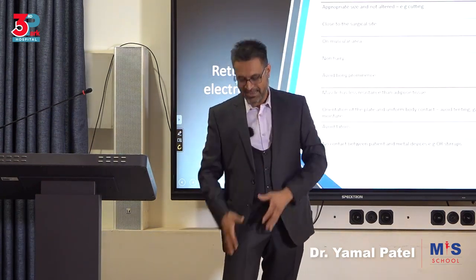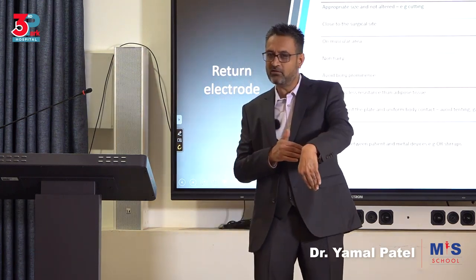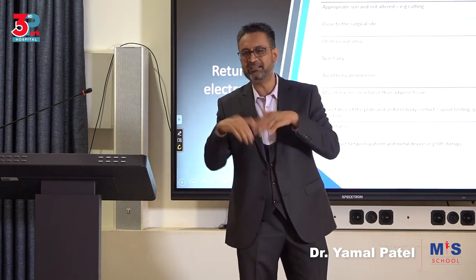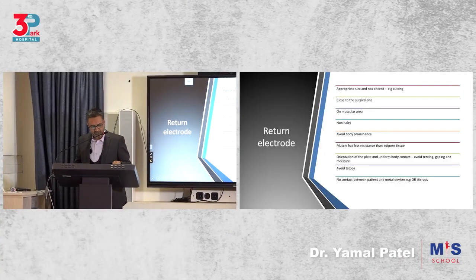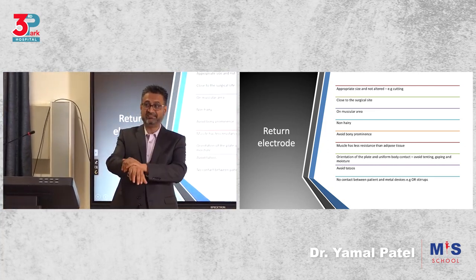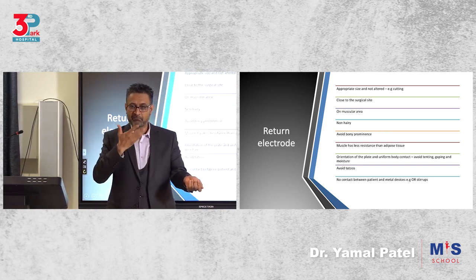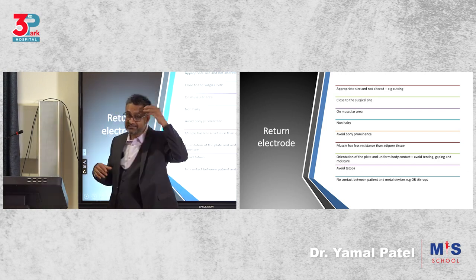Not like the sticky one, the blue ones that we have, the single use. The reason we don't want fluid on it is not because it will cause a short circuit. There's no short circuit here, but it will create a detachment and it will not allow it to stick well. You get what I'm saying? And because of that, it will not work well. Put it close, put it on muscular, put it on non-hairy. So if you have hair, ideally shave and then stick it, because otherwise it will stick to the hair and not to the skin. When it sticks to the hair and not to the skin, when you remove this, you'll have that burnt hair smell, because the hair would have burnt. You've understood.